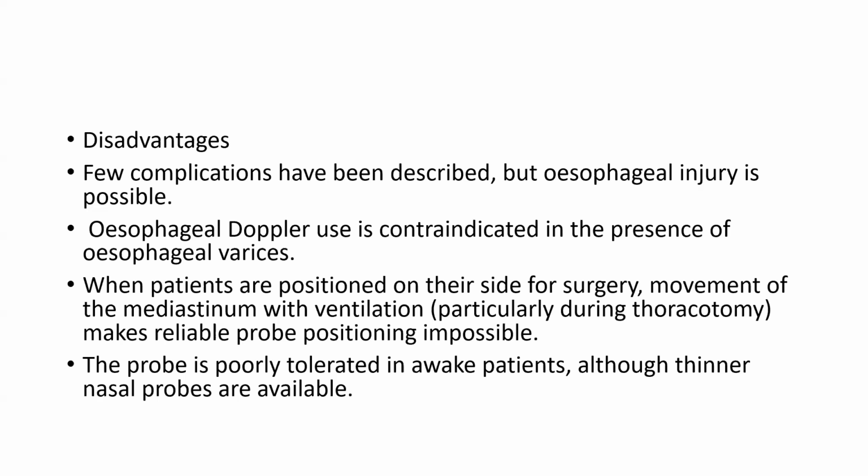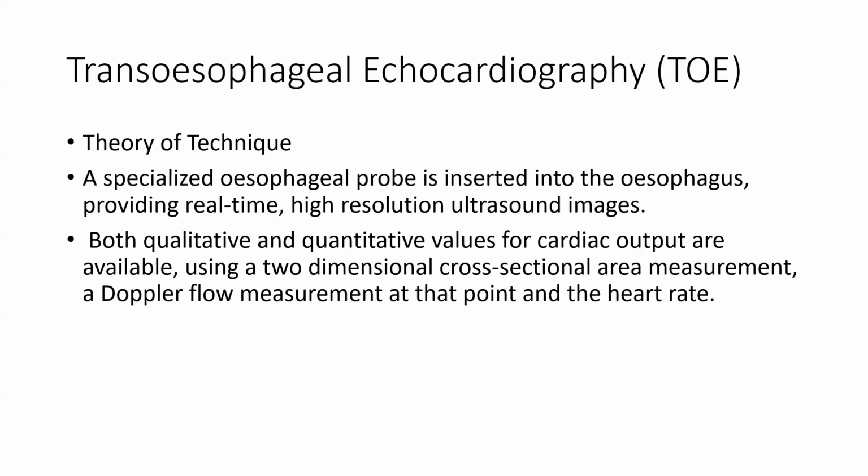When the patient is positioned on their side for surgery, movement of the mediastinum with ventilation makes reliable probe position impossible. The probe is poorly tolerated in awake patients, although thinner nasal probes are available.